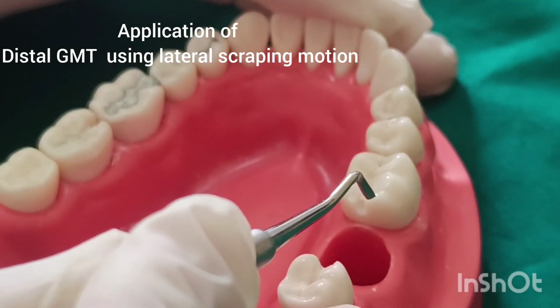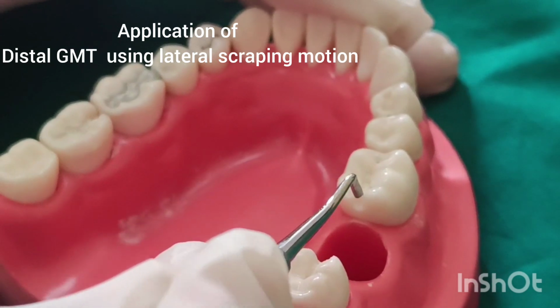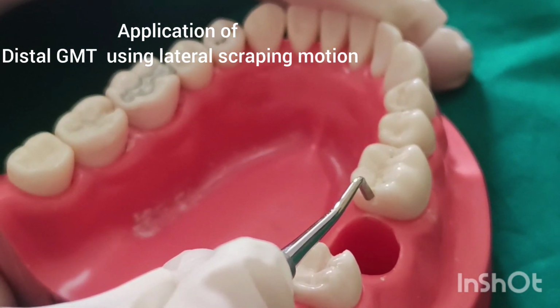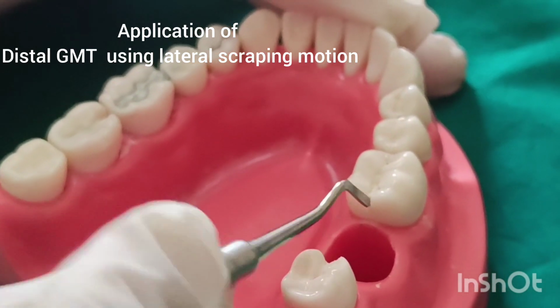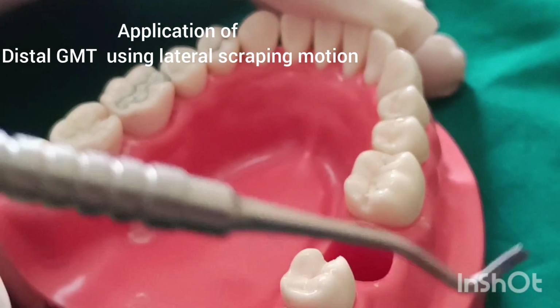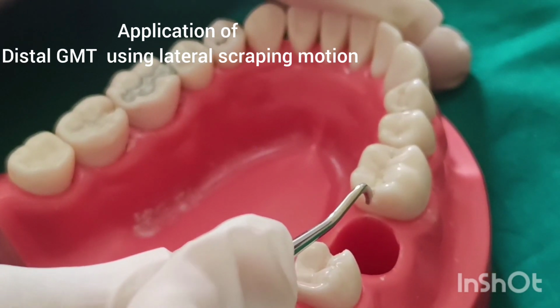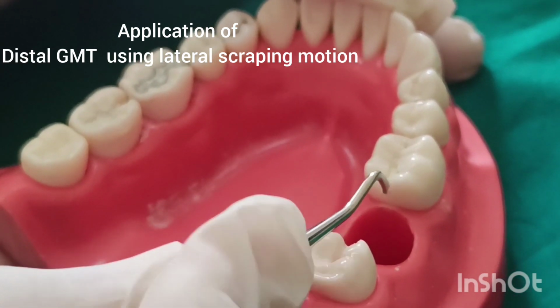For a distal cavity, we use a distal gingival marginal trimmer. Insert it into the cavity and do a lateral scraping motion to bevel the cavosurface margin. For the other side, flip the instrument and use a lateral scraping motion to bevel the margin.